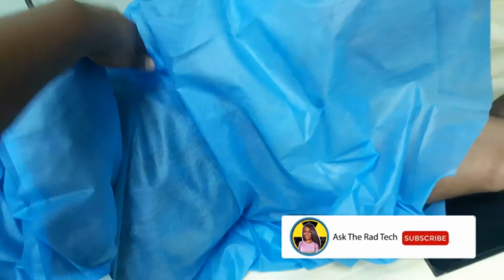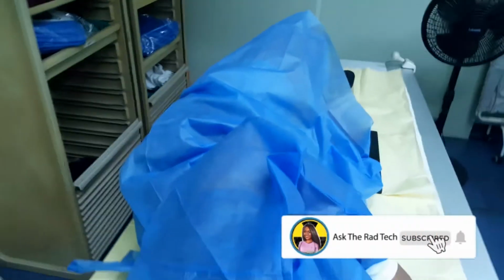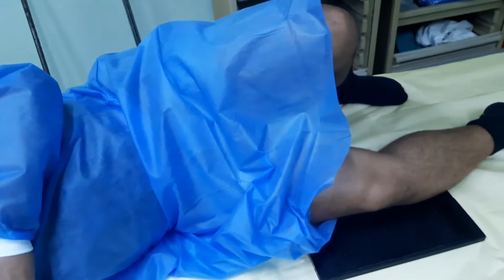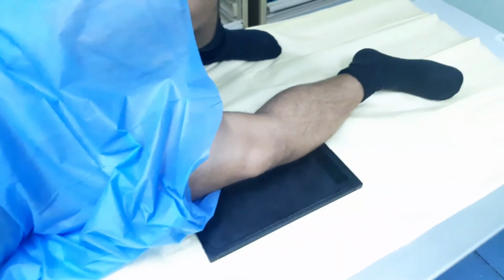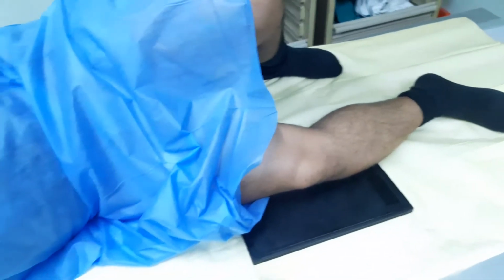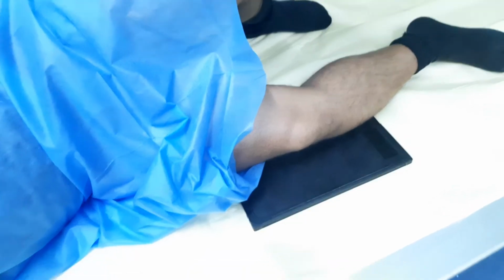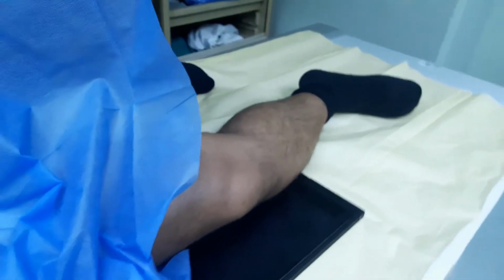Right, so a tip that I use, usually, you see how this lovely patient is lying down this way here. He's actually at, let me show you from this angle, right? Somewhat of a 45-ish degree angle, right? The body is tilted. He's not 100% on his side. And this is where we get a lot of knee rotation, or under rotation, I should say, where the knee isn't rotated all the way to the side enough. And then you get the condyles and everything not lining up and not looking good, right?